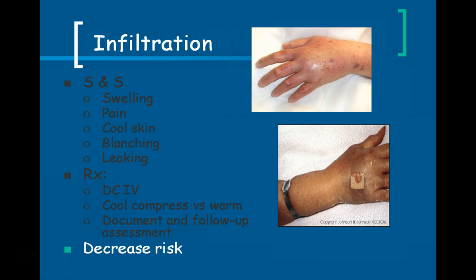Also, don't count on the pump letting you know that there's an infiltration. It can pick it up. It may beep and tell you that there's an occlusion, but again, it depends on how sensitive we set the pump to be, and often it doesn't catch it until it's too late. So it's important that we are able to see this infiltration within 2 hours so that we can catch it. It can cause tissue damage even if it's an isotonic solution like normal saline, because it's putting pressure against the tissue and can cause tissue damage.